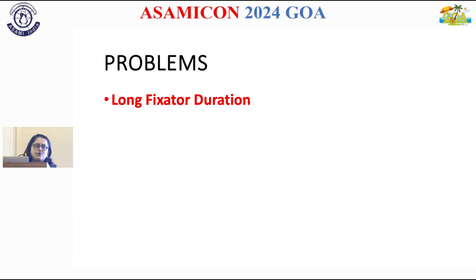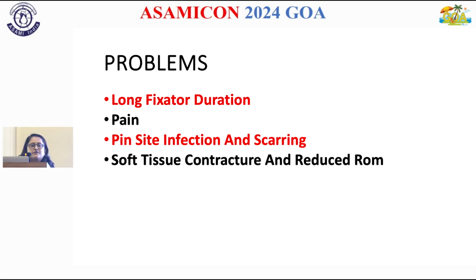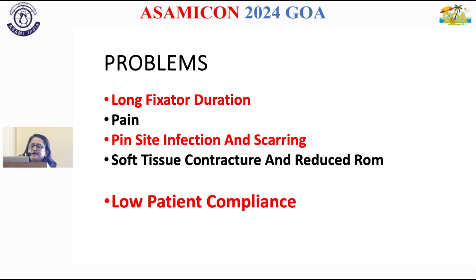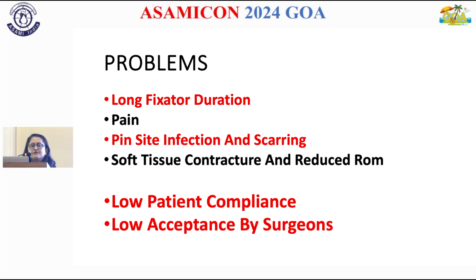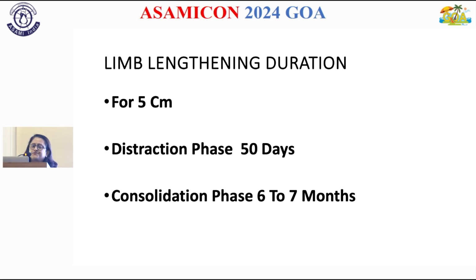But as more and more lengthenings were done, few problems were encountered, like long fixator duration, pain, pin site infection and scarring, soft tissue contracture and reduced range of movements. And all these things led to low patient compliance and low acceptance by surgeons. So many efforts were put in to overcome these problems.